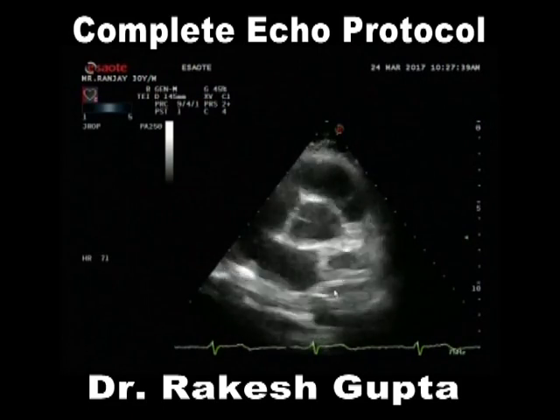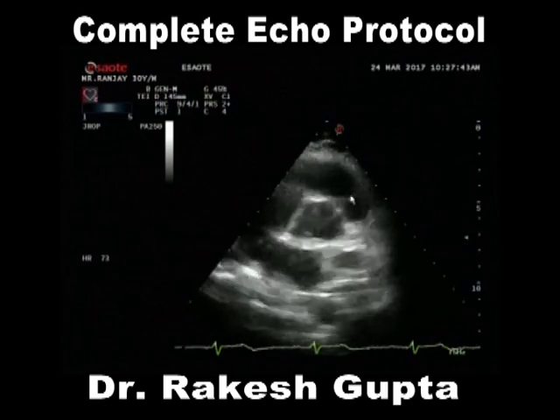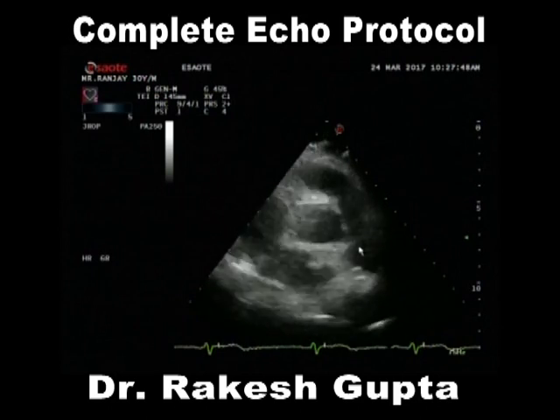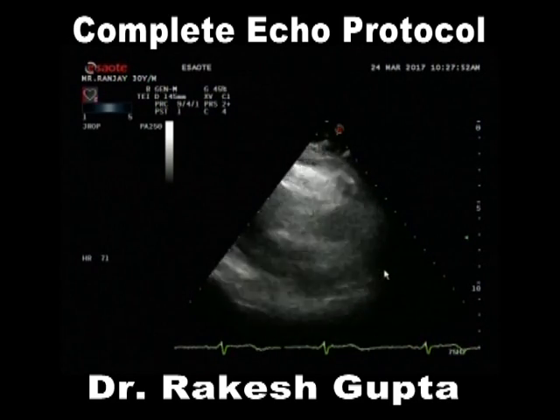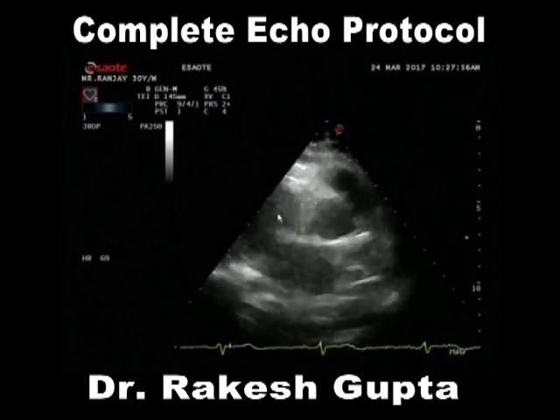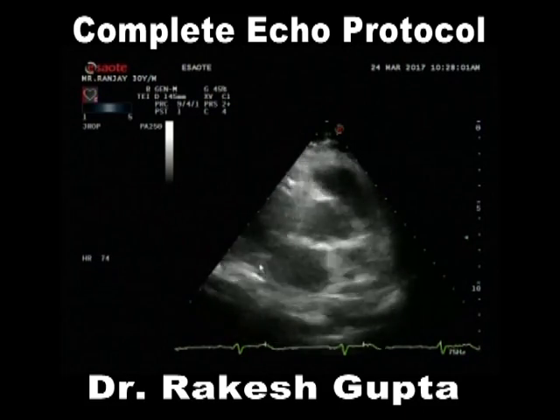Again we go from top to bottom, right to left. First we see the RVOT, then we see the pulmonic valve, and by angulation we can see the bifurcation of the pulmonary artery into right and left pulmonary arteries. Here we see the tricuspid valve, RA, LA and interatrial septum.